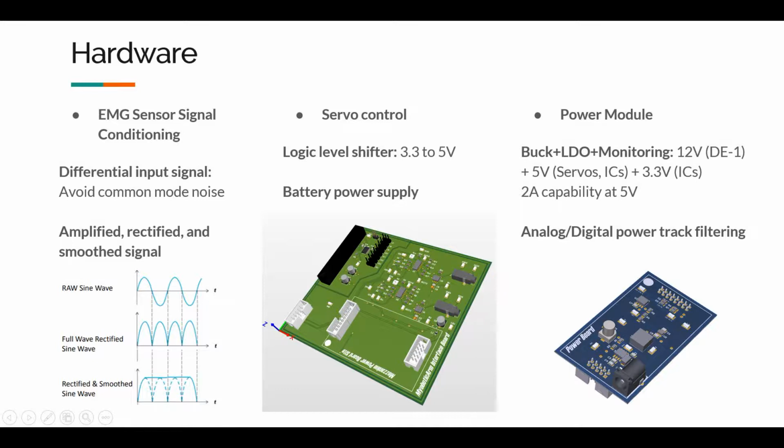And for the servo control, we directly interface the GPIO with the logic level shifter to transfer the 3.3 volt signal to 5 volt signal to directly control the servo. The power source is used to power the EMG interface, and we have the power board to power the motor logic level shifter.